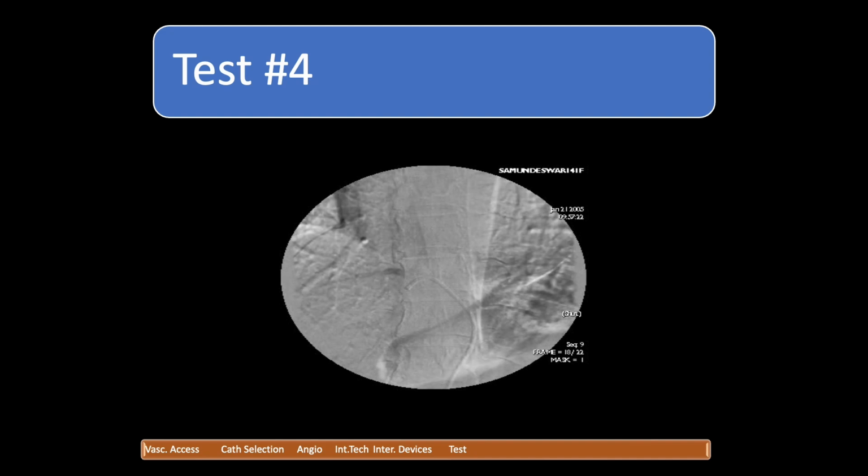What is this one? Angiogram. How do you do angiographic interpretation? I told you, you start with catheter position, arterial phase, capillary phase, venous phase. So if you look at this one, where is the catheter? Catheter is coming from where? From below or above? From radial or femoral? What is the level? Is it above the cardiac shadow or below the cardiac shadow? Below the cardiac shadow.